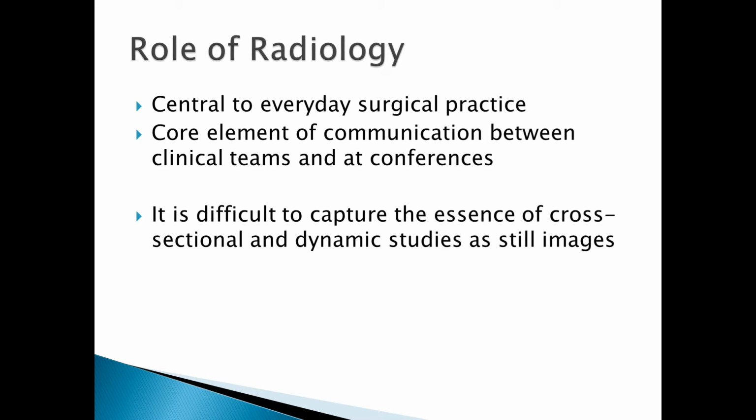Imaging is not only pervasive in the workplace, but is also a staple of presentations at surgical conferences and in medical education. Oftentimes, the imaging modalities we rely upon the most are cross-sectional or dynamic studies, such as CT, MRI, or fluoroscopy. As I have already mentioned, it is difficult to capture the essence of these three-dimensional studies using prose or still images. So how can we make things better?